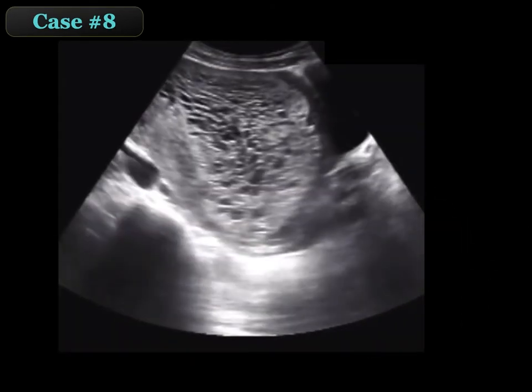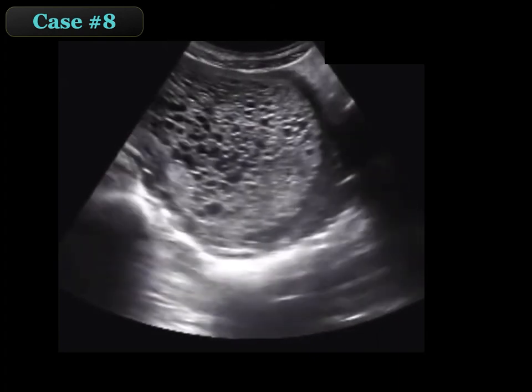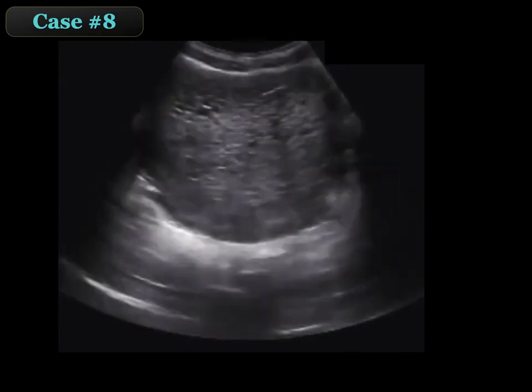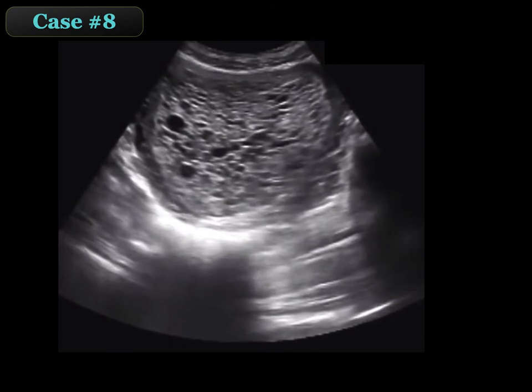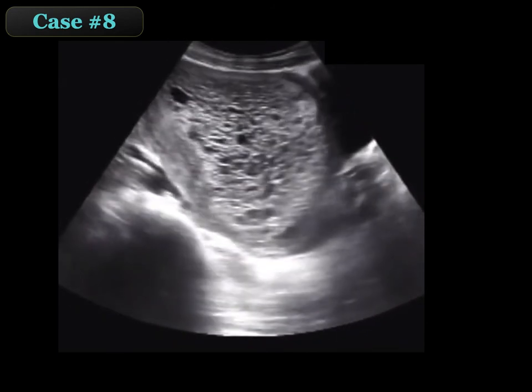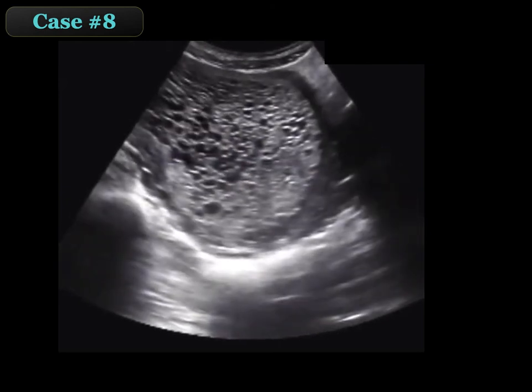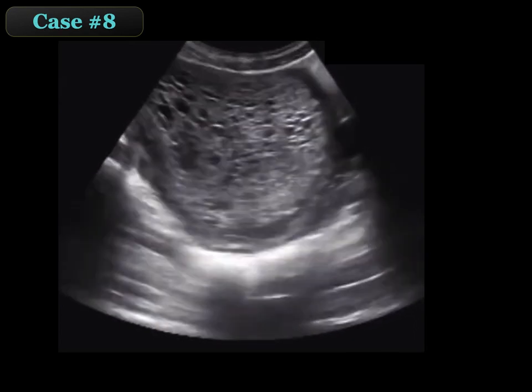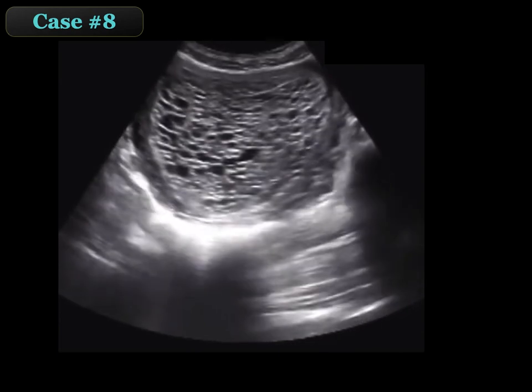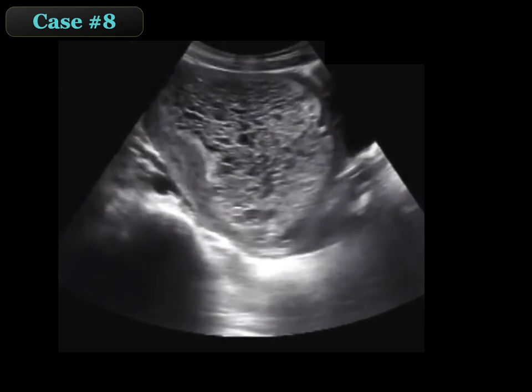All right, finally, we have a patient who presents to the emergency department with a positive HCG. Home pregnancy test was positive, and now she comes to the ED because she's having abdominal pain. This is a curvilinear transabdominal OB ultrasound looking at the uterus, and we are in the longitudinal position. We see the bladder, a small bladder to the right of the screen at the very end of the clip, and then we see the uterus as we're fanning through.